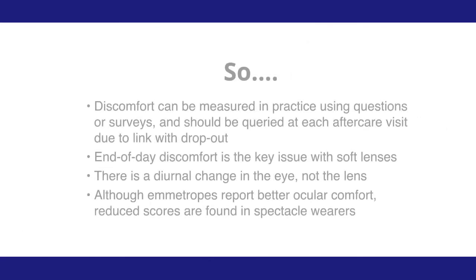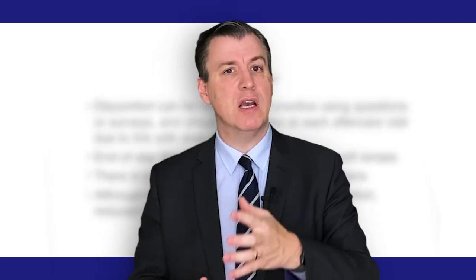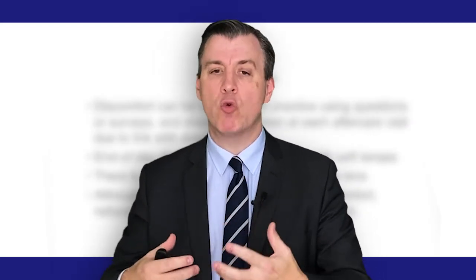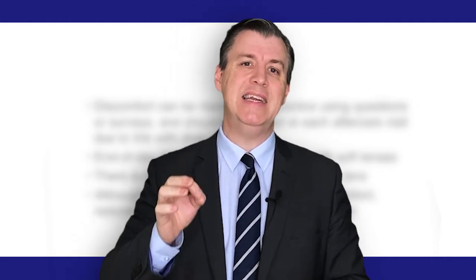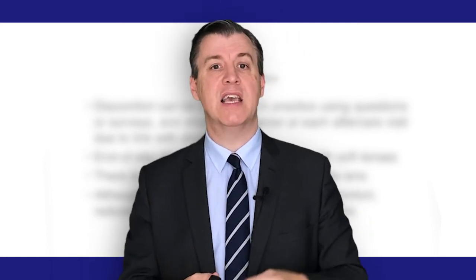So what do we know? Well, we can measure contact lens discomfort. It would be nice in practice perhaps to do the full questionnaire, and that would give us some benefit, but I think just scoring a number out of 10 is probably a reasonable thing to do. But I do think, because of the importance of this issue, it needs to be done at each and every contact lens follow-up or aftercare visit.